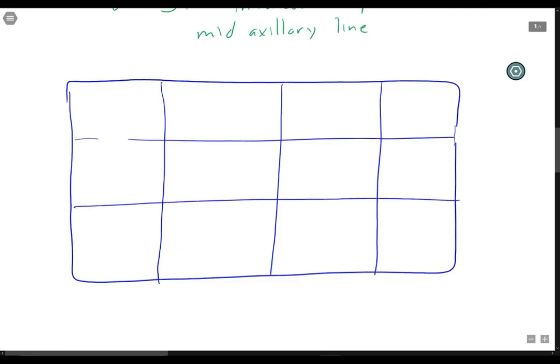In each one of these boxes, you'll have some ECG, but these boxes are separated very specifically, where in this box, you'll be looking at the ECG from lead 1. In this box, it'll be lead 2, so maybe the waves are a little bit bigger. Lead 3, I won't draw the waves in all of these, but you'll get an idea. And then AVR is here, so everything is upside down.